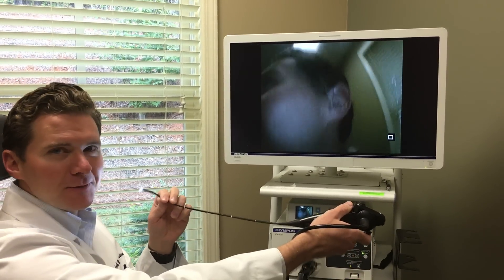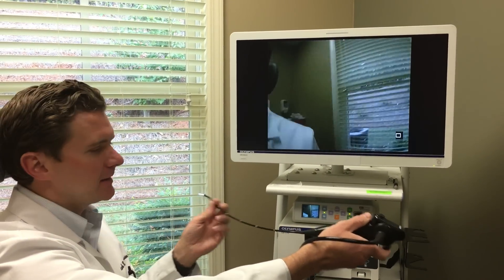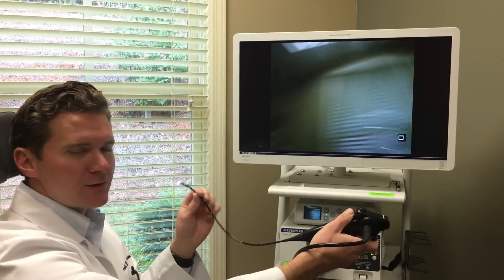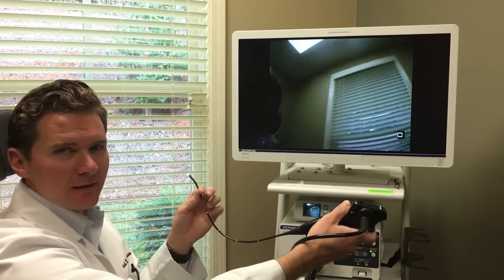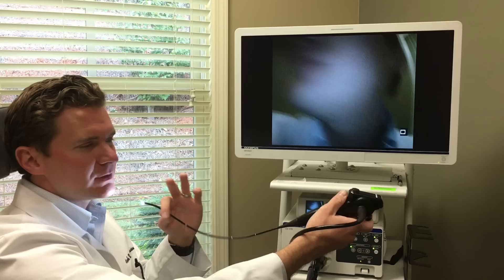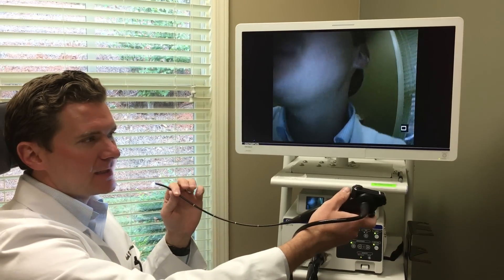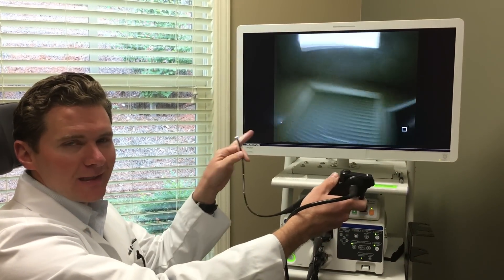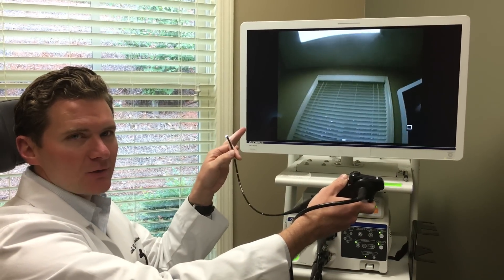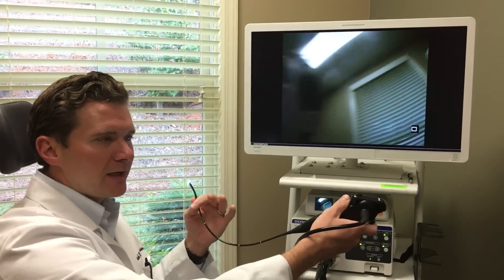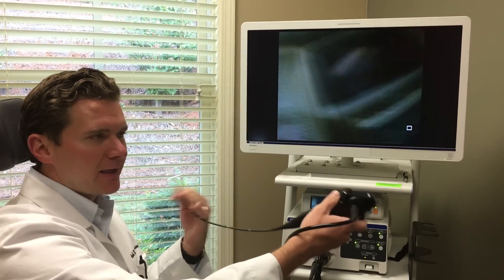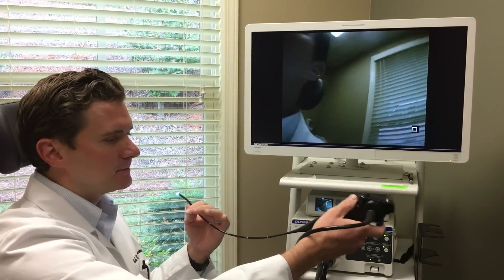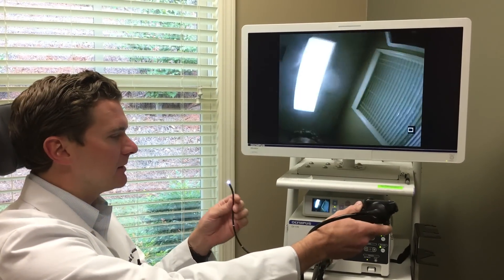All right everybody, Dr. Van Dusen here. I'm gonna show everybody what this scope exam is like. So first I'm gonna start on the left side of my nose, point to my nasal septum and my turbinates, and then I'll go to my right side and I'll try to show my vocal cords, but it might be a little hard.